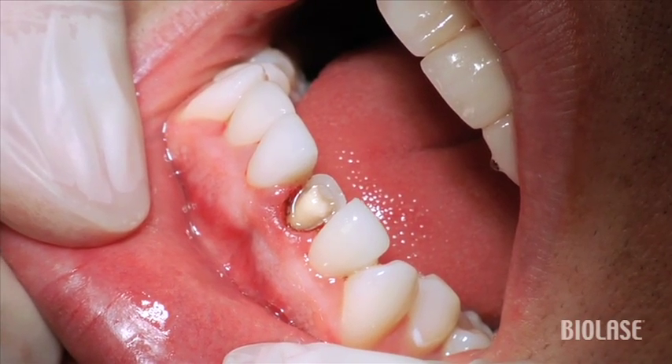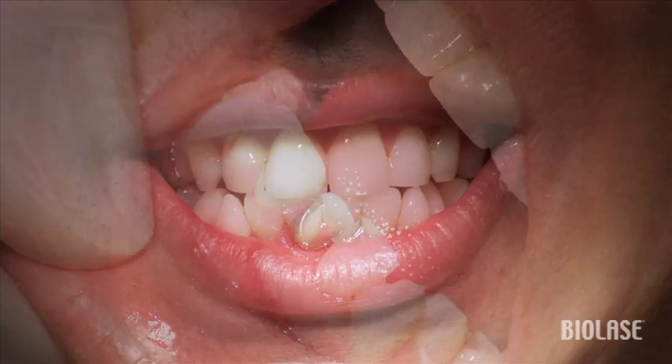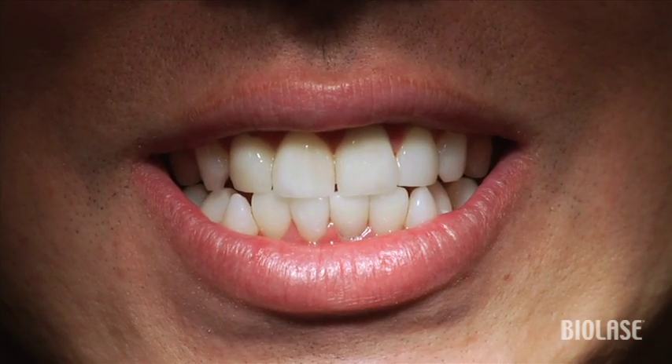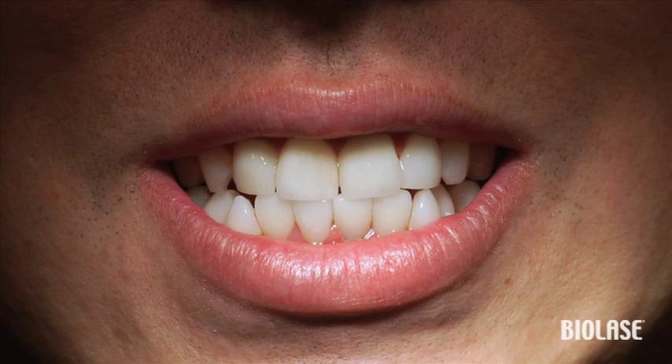Here's our completed gingivectomy and troughing, ready for an impression. And here we have his old veneer temporarily placed back in position. Notice the health of the tissue immediately post-surgery — there's no bleeding and there's no charring. So we know that this case is going to heal very nicely.